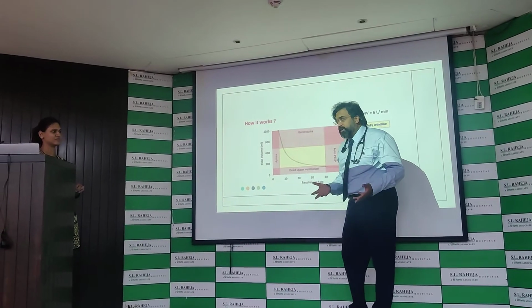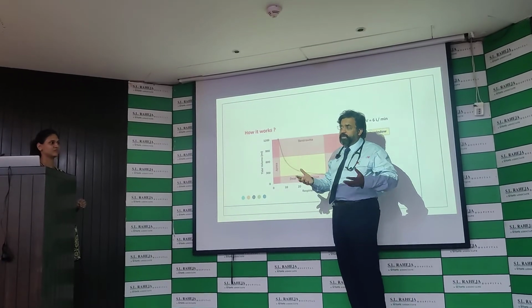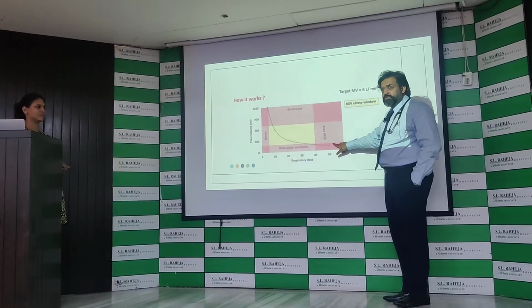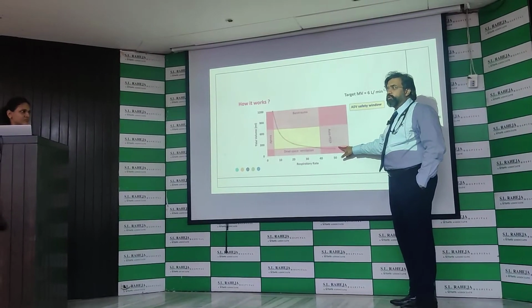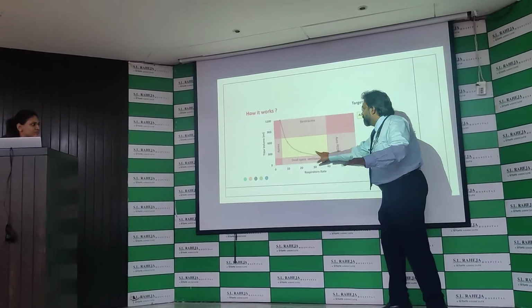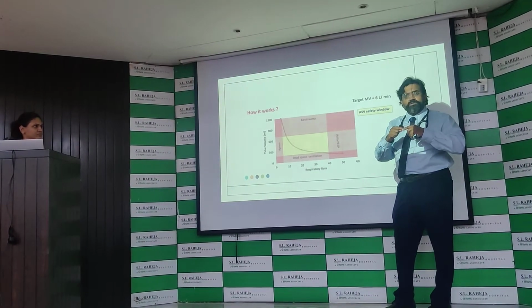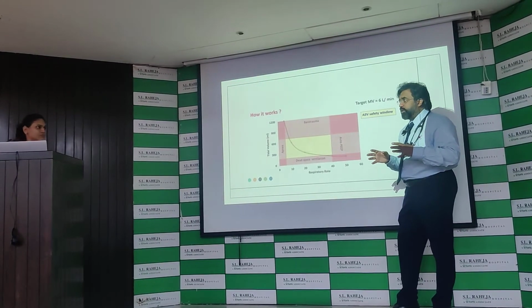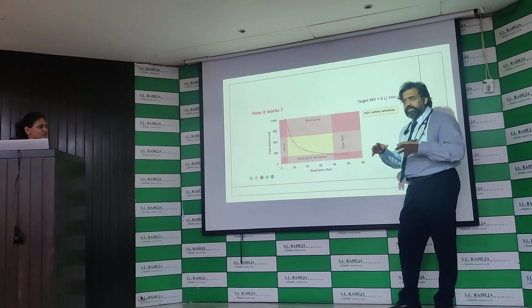Otherwise, what I would do if this patient is breathing fast, because he is having compliance issues. So if he is breathing fast, he is somewhere around here, the outer box. Right? So what will this ventilator do? It will try to slowly increase the pressures, increase the volumes, so he gets a little bit more volume. So his RR will come down, and this plus sign will come into this. It does this on a breath-to-breath basis. You are understanding? So the plus comes inside. Not a single breath is out of this. That's the point. One breath may come, so again everything has to become normal again. That is the intelligent part of the ventilation.